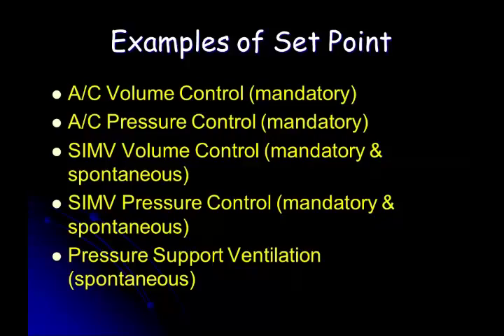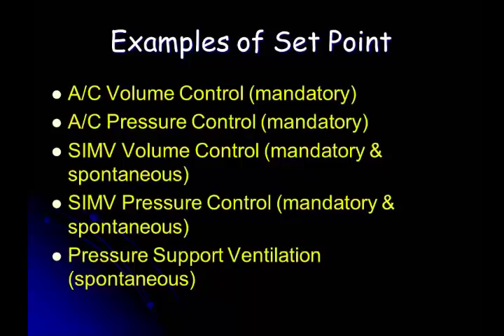In assist control, volume control, there's a fixed volume which is delivered whether the patient triggers the ventilator on or the patient is apneic. It'll still deliver a fixed volume. We good on that concept? And the mandatory just means mechanical, right? The mandatory means that these are mandatory breaths, mechanical breaths. These are not on the part of the patient. Patient may trigger it on, but it's ended by the machine. Always. Every breath. Okay? When I say mandatory, I mean the patient doesn't end it. Possibly not even start it.